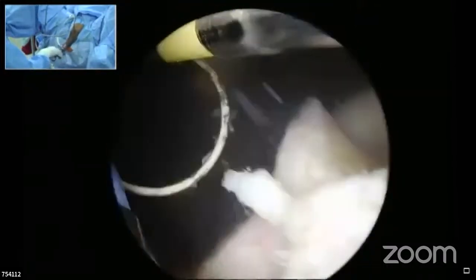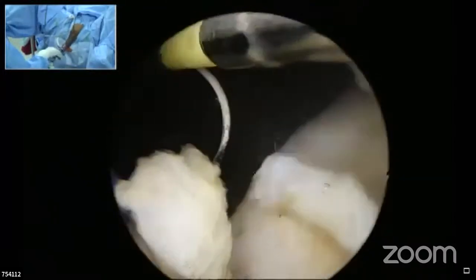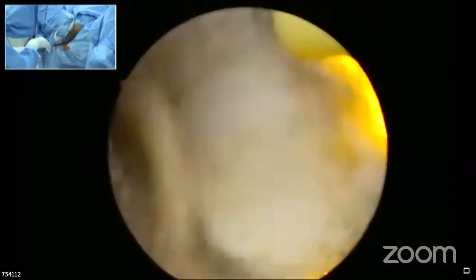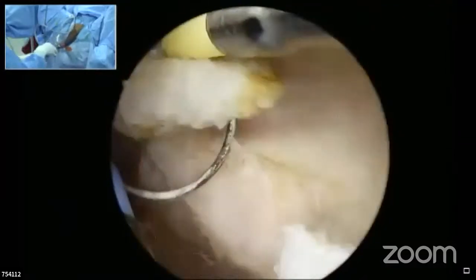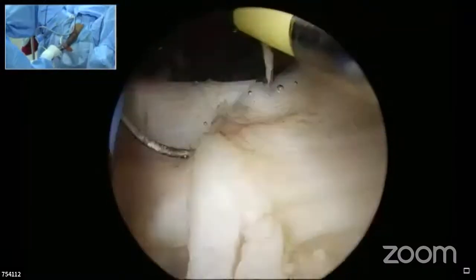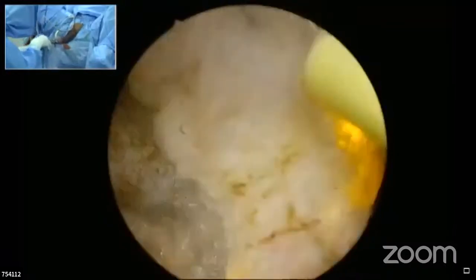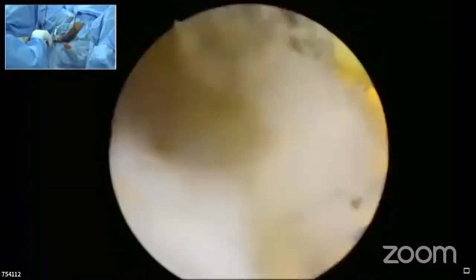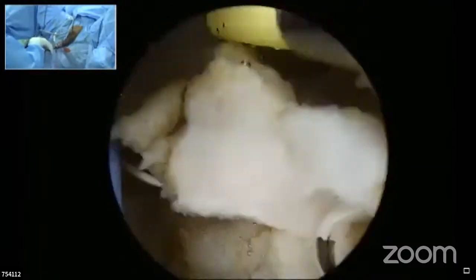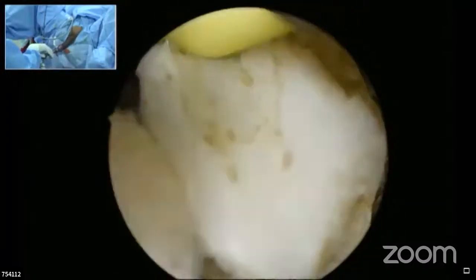Yes, the efficiency of the bipolar absolutely increases by having a warmed up saline. Warmed up saline creates a better corona in a very small period of time, so your ability to cut the tissue will be much better. We ignore that point and start using very cold saline, and then you say that my bipolar is not cutting. Whenever you have that sort of problem, you need to have a warmed up saline, especially when you're using slightly bigger loops.